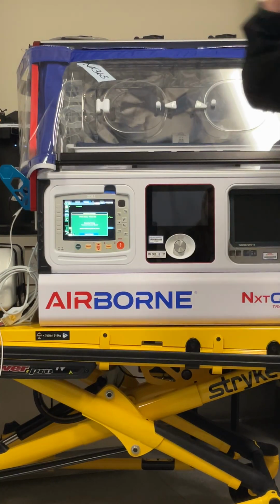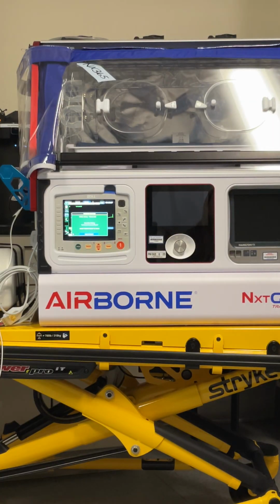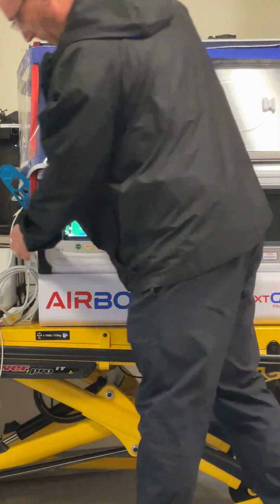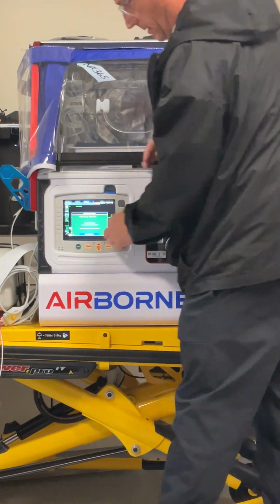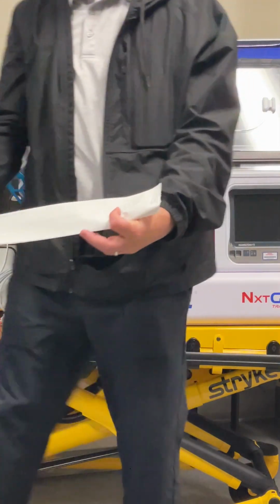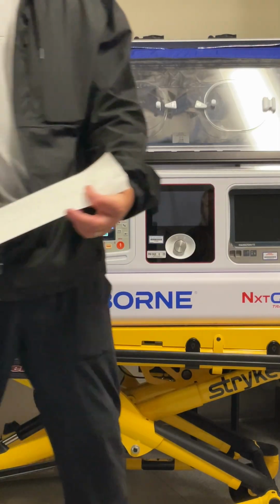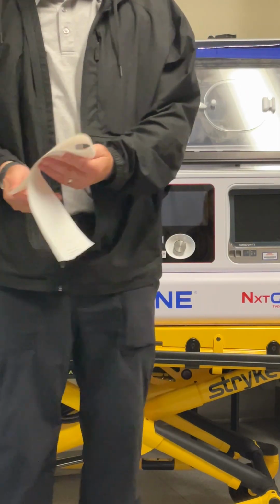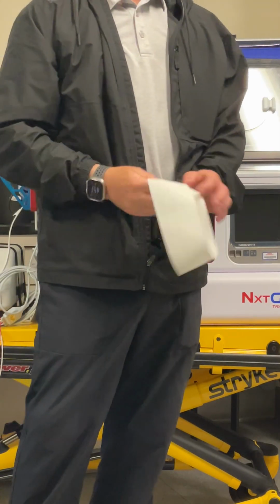That's going to be a really, really long strip. That's all your timestamps, all your strips associated with those timestamps. So every time I hit one of those code markers, it would be logged in there. If I did a whatever, it would be in there. Gave energy. Once it gets to the rhythm strips, you can print it off. So that's all the stuff that it did, and then it has all the strips that are associated with each one of those stamps.